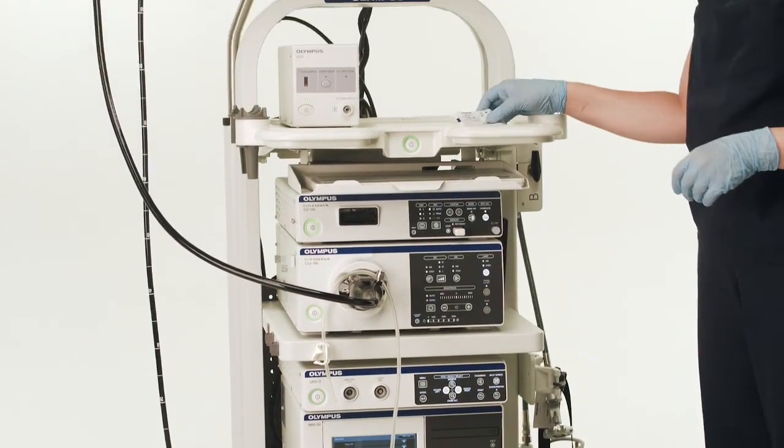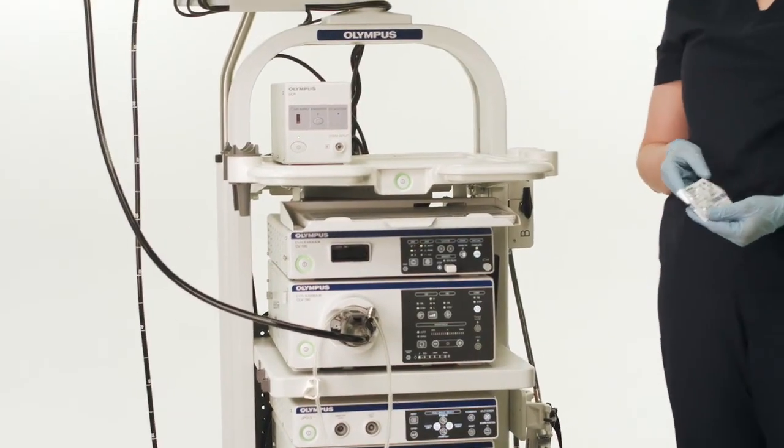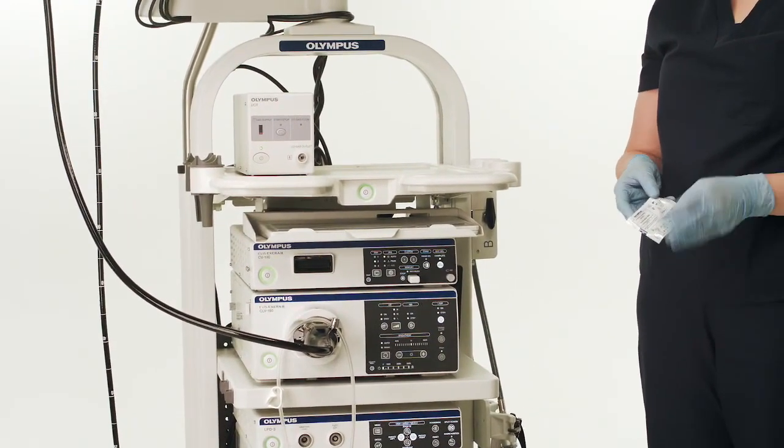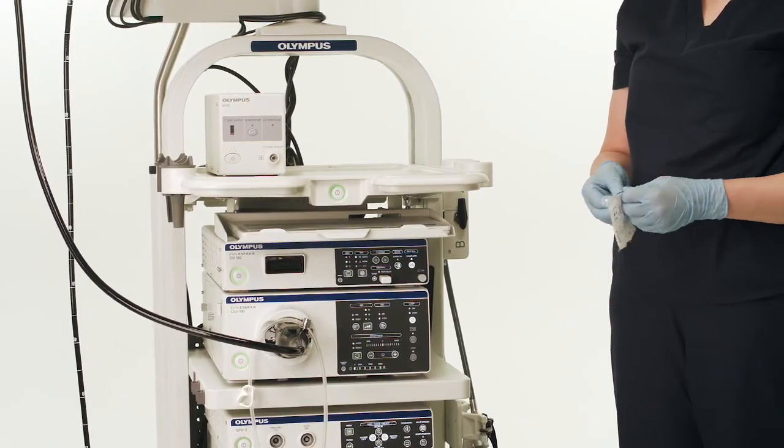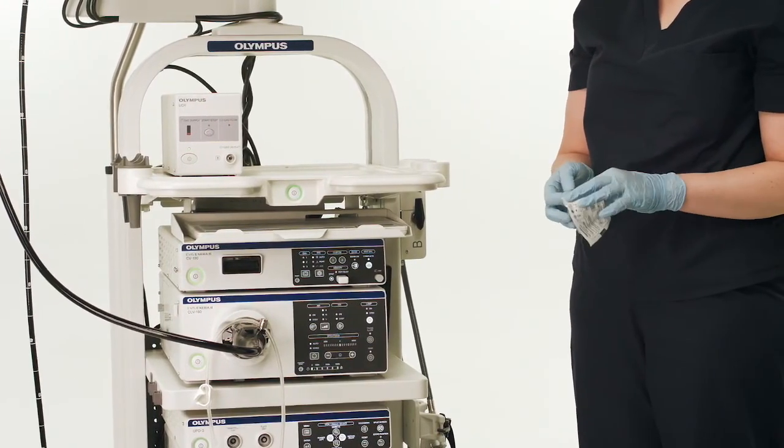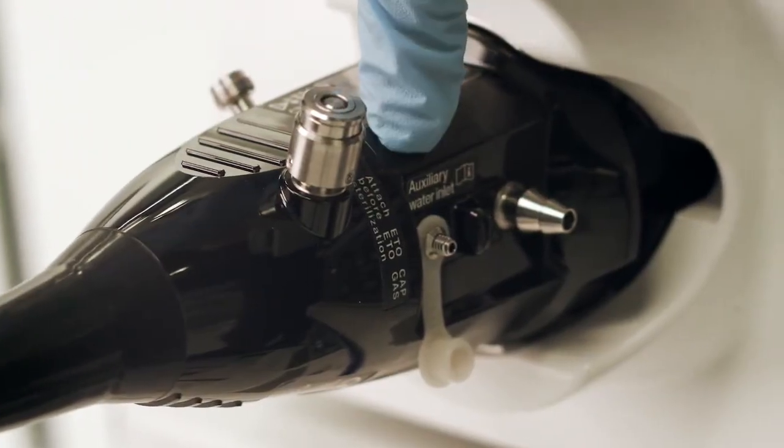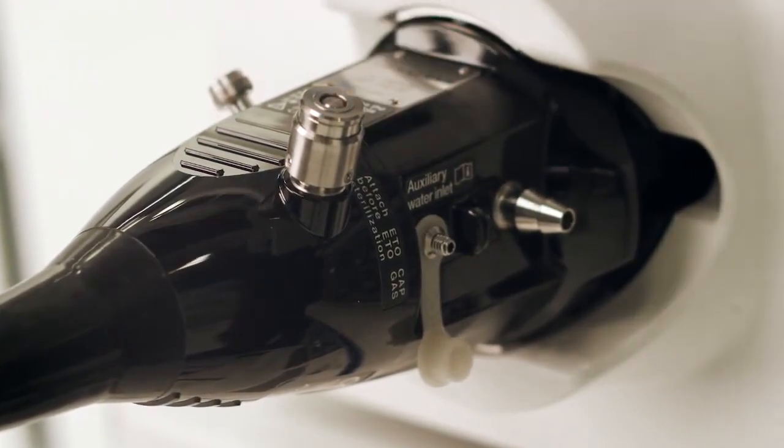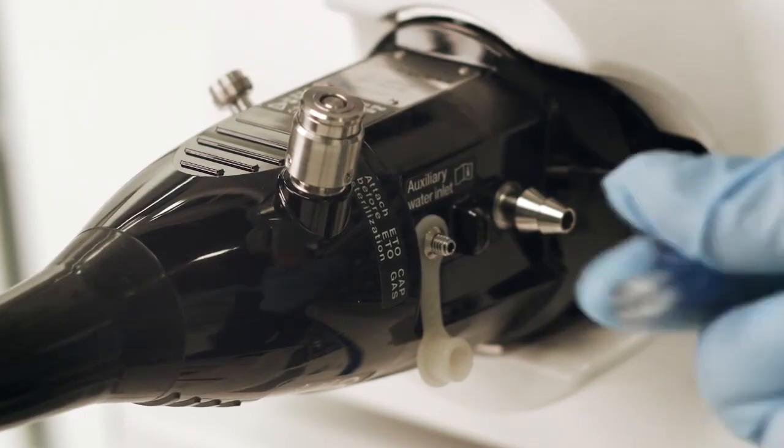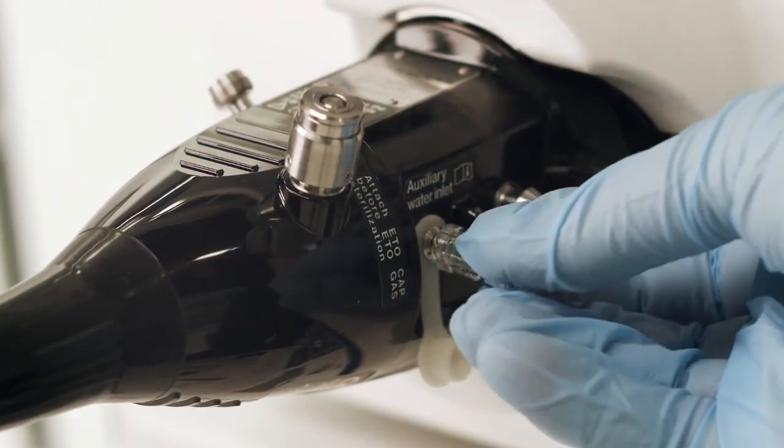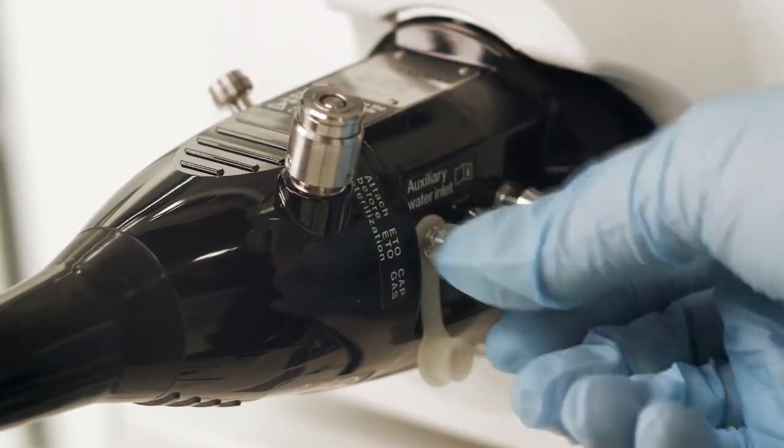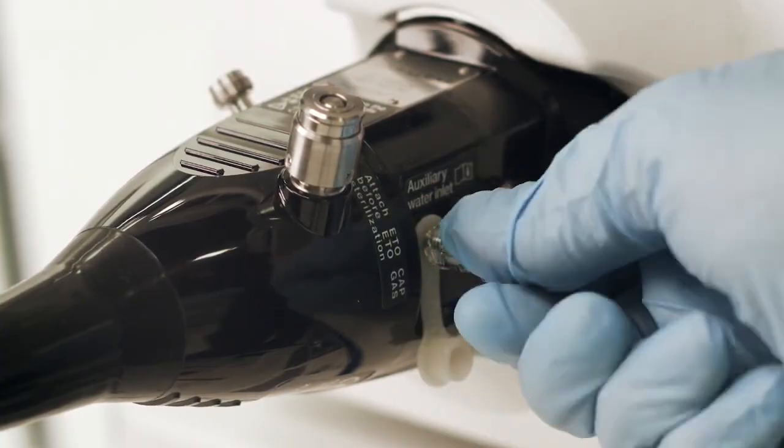Now locate the MAJ 1652 auxiliary channel adapter, removing the adapter from its sterile packaging. Locate the auxiliary channel connection point on your Olympus endoscope. Attach the adapter to the auxiliary channel connection point by screwing the adapter down onto the connection. Be sure that this connection is tight.